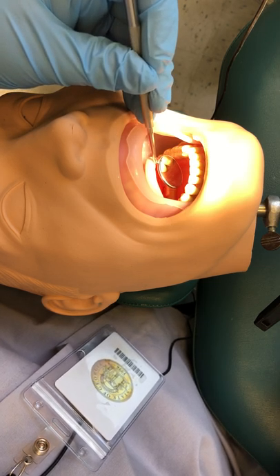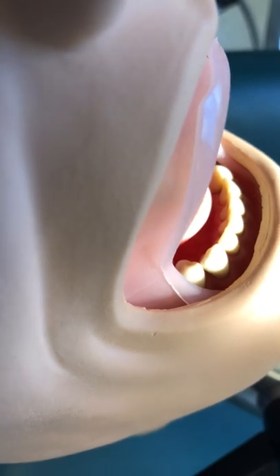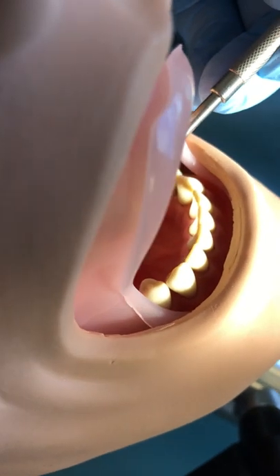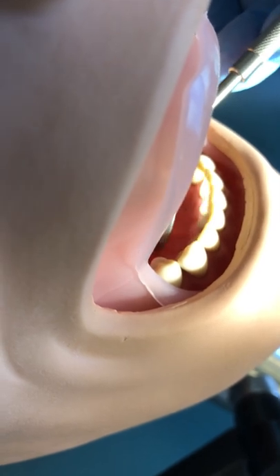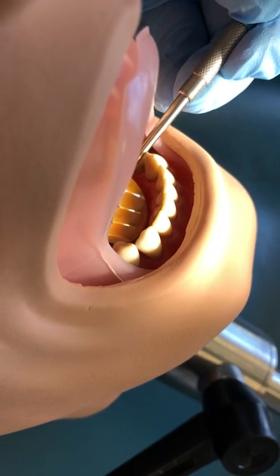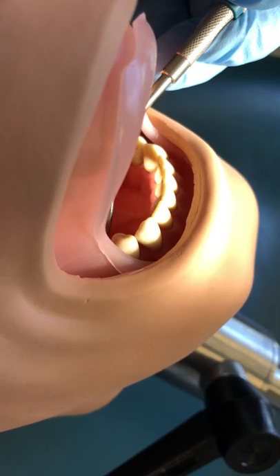Switching to the operator view: from this perspective you can see that the lingual surfaces are in shadow. I can place my mirror and reflect the light off the mirror surface onto the teeth, making it easier to see. Without reflection the surface is dark, but with reflection you can see the light travel up and down the teeth. Using indirect vision, you can see the lingual surfaces reflected in the mirror, and when I tilt it down to capture that operatory light, those lingual surfaces become illuminated.